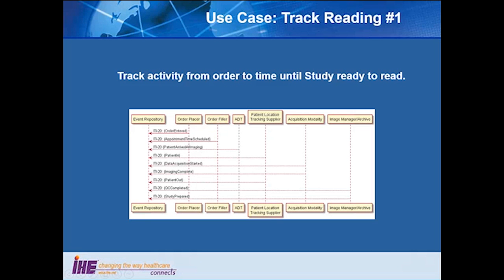The patient location tracking could track when they go through the door into the room, say it's a CT, into the CT room. The acquisition modality could say when it started and when it finished. The location tracker could say the patient's left the room. QC could say, yep, good images, and the study is ready to read.